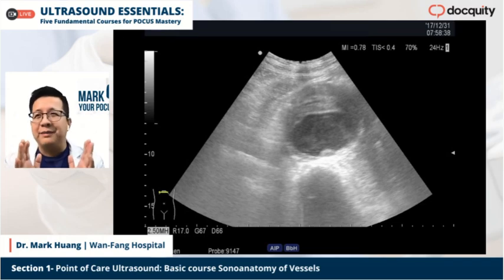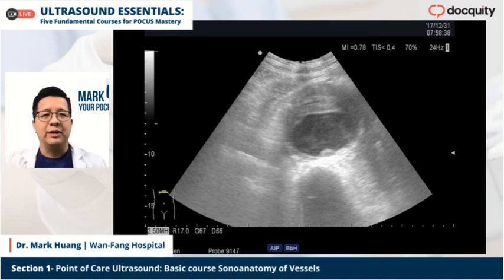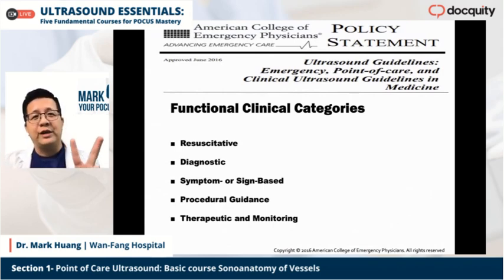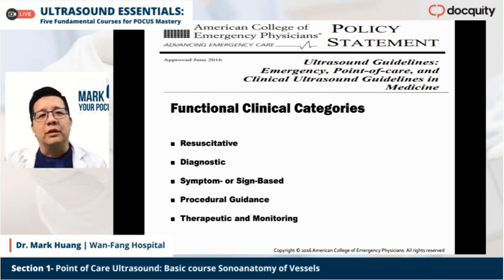So that's what I mean. The POCUS is important because it lets you realize and recognize your thinking immediately. So it's quite important. Today, in our vessels introduction, I will introduce two major vessels. This is all based on the American College of Emergency Physicians policy statement on point-of-care ultrasound.